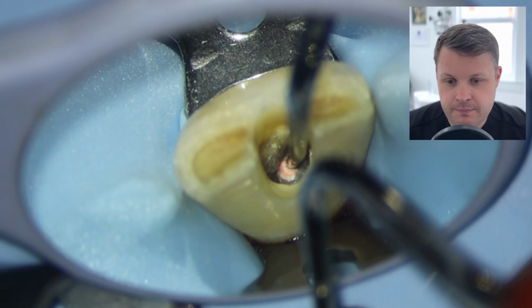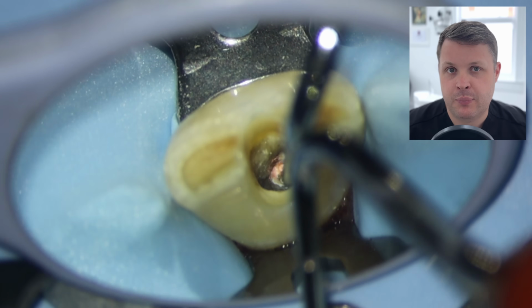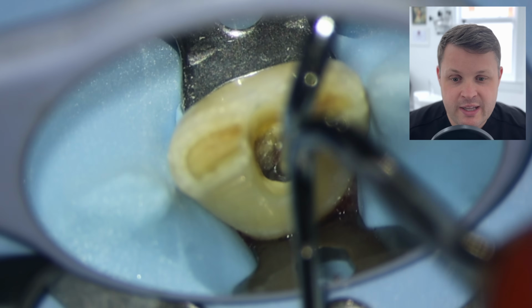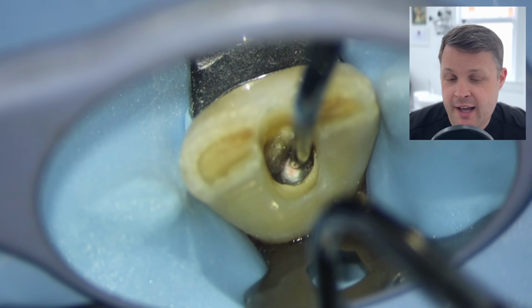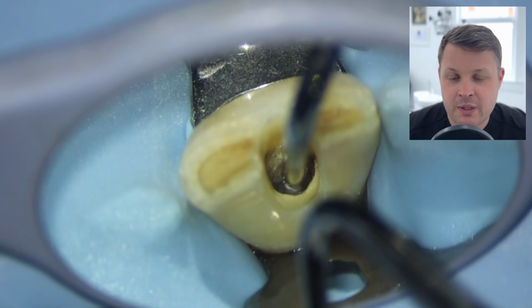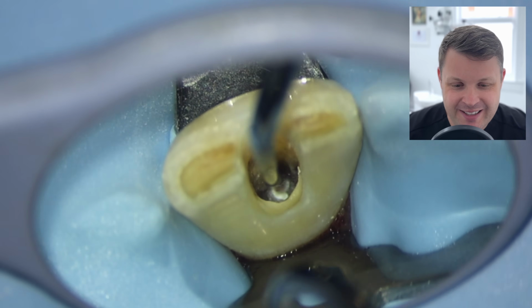And if you leave GP above the CEJ or within the pulp chamber itself, it's a surefire way of making sure that the tooth will become discoloured if it isn't already discoloured.